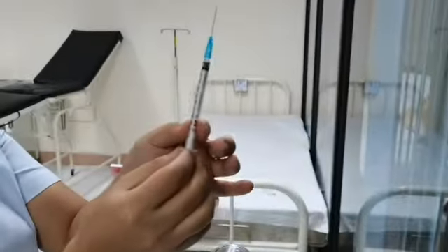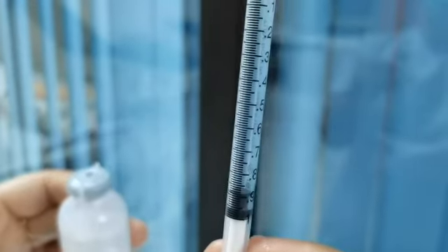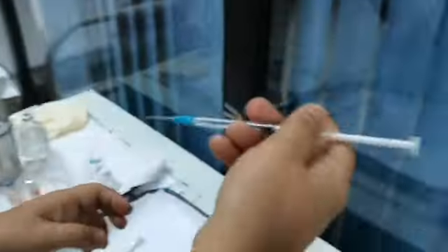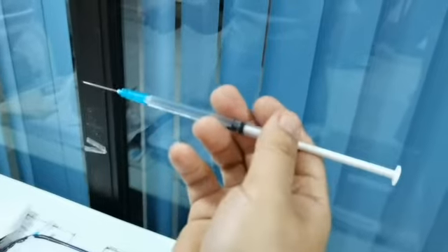So you open the cover of the needle. Since you are going to get 0.9 ml of distilled water, you move this plunger down, and it should be 0.9 ml as you can see on this level. So you get the diluents now. Then you hold the plunger like this. Make sure that your thumb and your index finger are supporting the plunger.